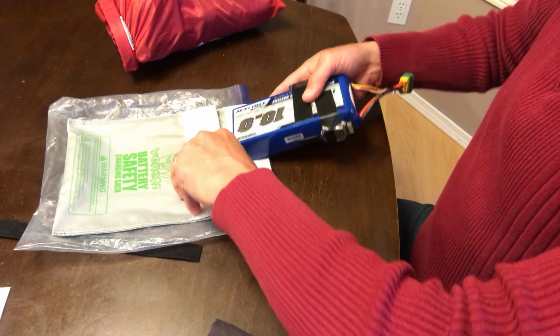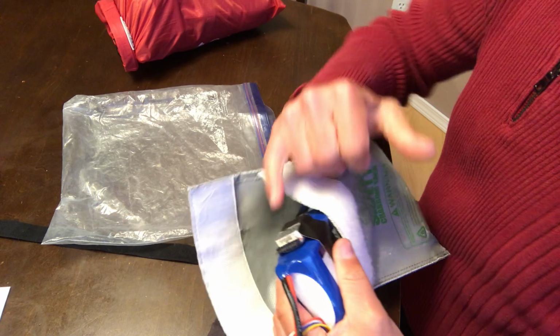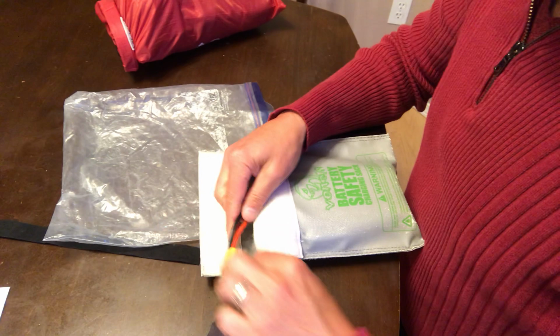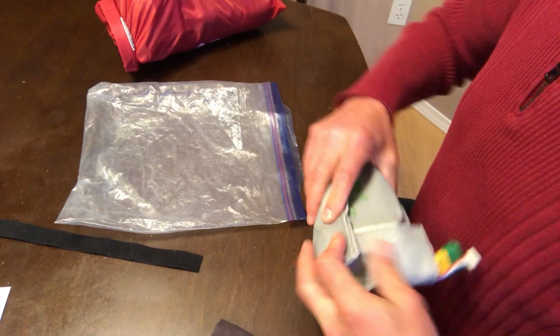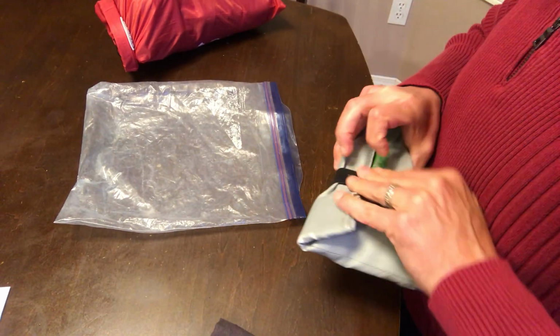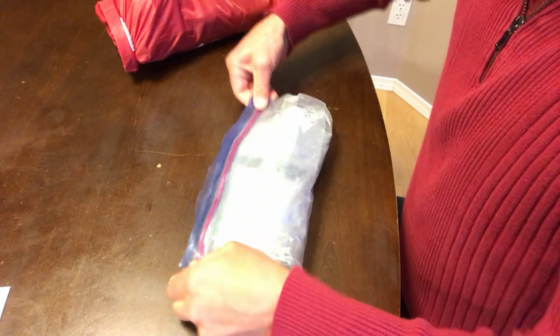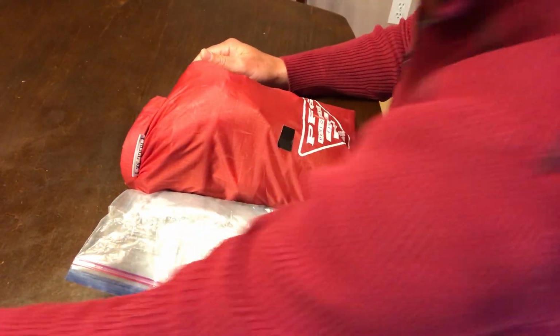And then doing the same thing for your battery. And you do have to be careful with these prongs sticking out. You don't want to damage them, so I would, and then I would leave these out so that I had access to them. I didn't always have to undo everything. And so that's pretty tight. And then that's done. So there's your whole kit. Actually quite small, packs up really nice.